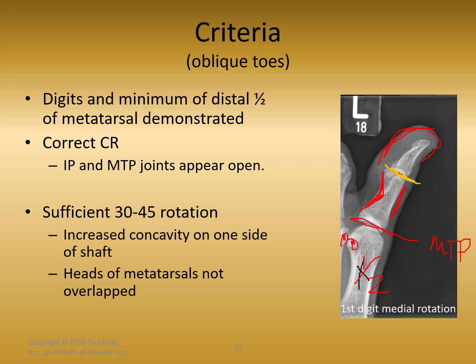So on these obliques, we definitely need to make sure that the part itself is parallel to the IR. Even while we're doing that rotation, we're still looking for the part to be placed parallel with the IR. So we don't want them pulling their toes up, like pointing their toes up. We don't want them scrunching their toes down onto the board while they're positioning. You may have to touch your patient's foot a little bit and ask them to relax their toes into a more relaxed position so that you can get them into place nicely.